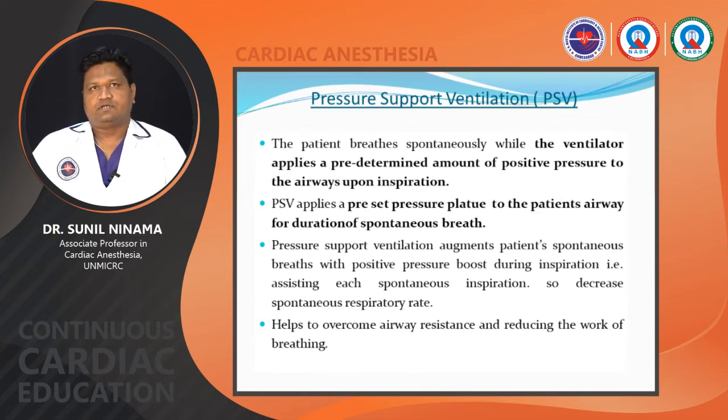Pressure support ventilation. The patient breathes spontaneously while the ventilator applies a predetermined amount of positive pressure to the airway upon inspiration. Pressure support ventilation applies a preset plateau pressure to the patient's airway for the duration of the spontaneous breath. It augments the patient's spontaneous breath with a positive pressure boost during inspiration, assisting each spontaneous inspiration, so it decreases the spontaneous respiratory rate. It helps to overcome airway resistance and reduces the work of breathing.